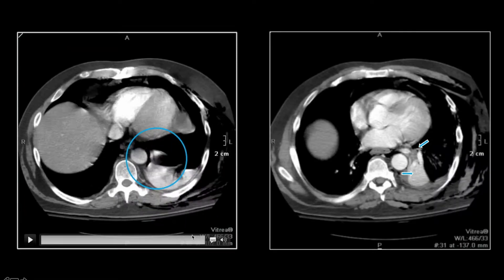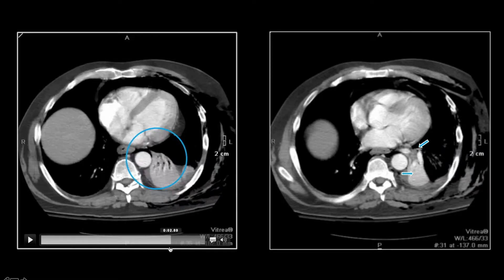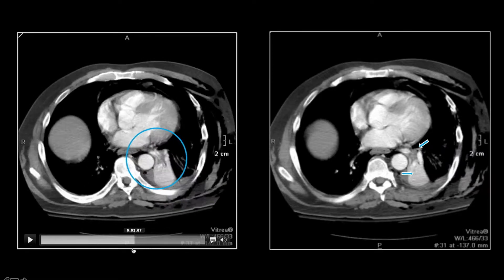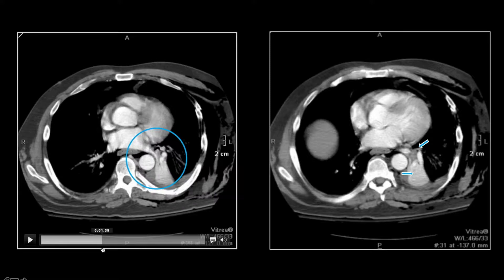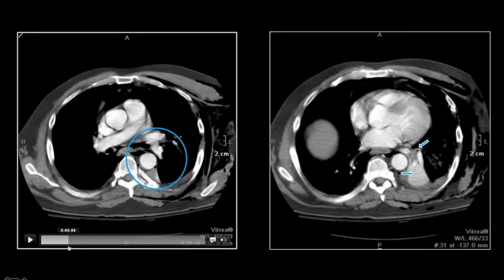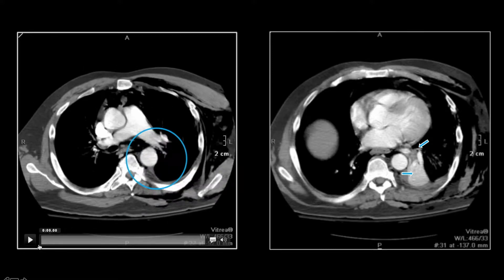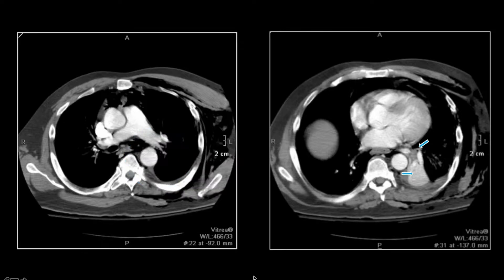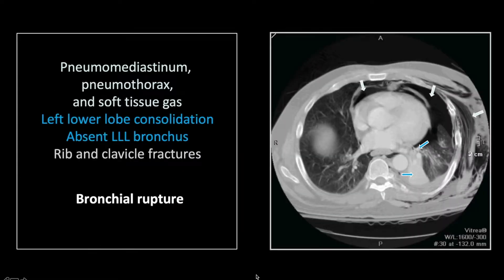Note also the failure to follow the bronchi and connect them with a patent left lower lobe bronchus. That combination of abnormalities — collapse of the lung or a lobe, pneumothorax, and pneumomediastinum — should always suggest bronchial rupture.